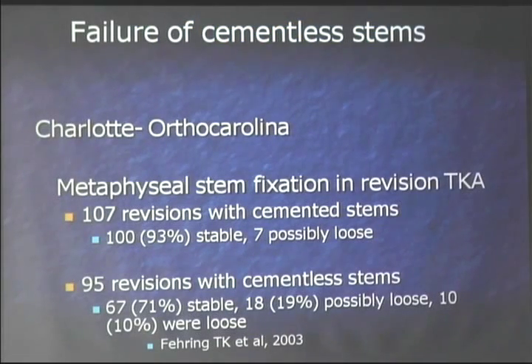When it comes to the question of whether to cement or use cementless stems, I think there are really two institutions that favor the use of cemented stems. The first is Tom Fehring's group in Charlotte at OrthoCarolina, and this comes from their 2003 paper where they looked at cementless stem fixation in revision total knees. When they used cemented stems, they had 93% stable components, but when they used cementless stems, they had a much poorer result: 71% were stable, nearly 20% were possibly loose, and 10% were in fact loose.